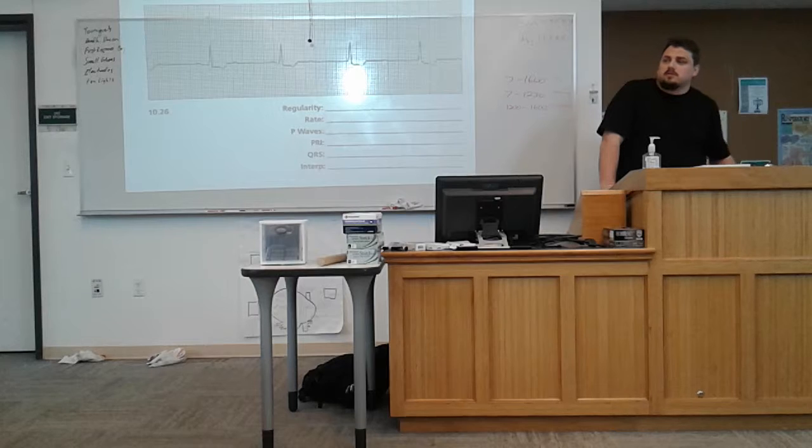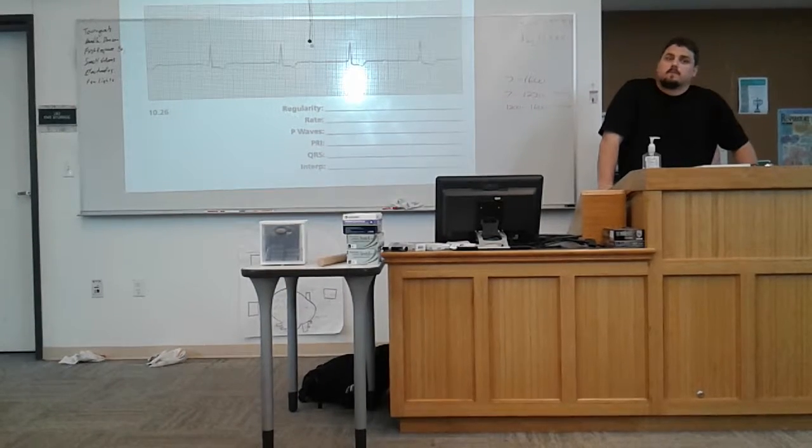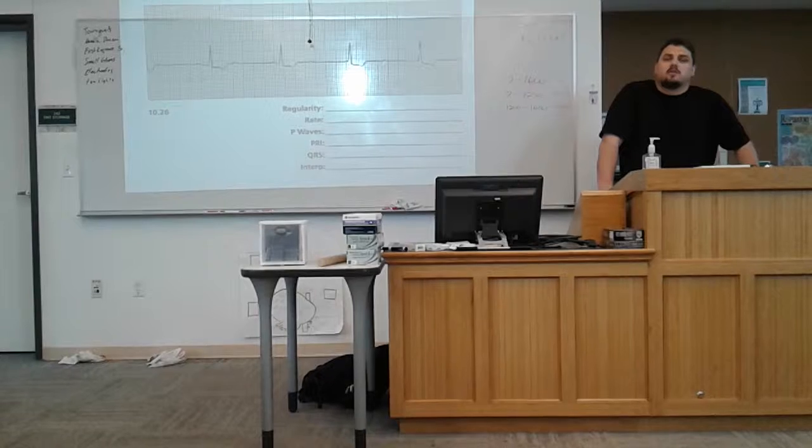So when you're saying it's a third degree, you need to indicate that it's junctional in nature rather than ventricular in nature. So where would that go in your reading of the rhythm? Would that be at the end because it's the least? Junctional third degree heart block with, would it be a third degree heart block with ST depression, flipped T wave, and a junctional? I would say a junctional third degree heart block.